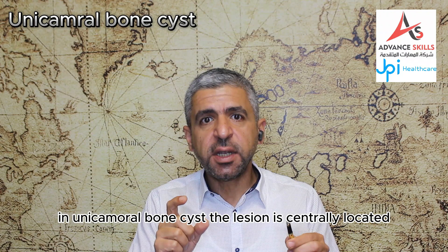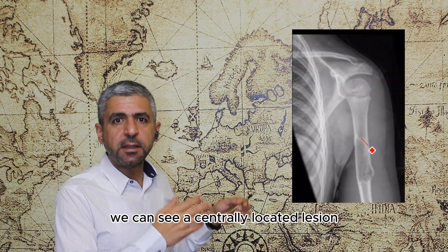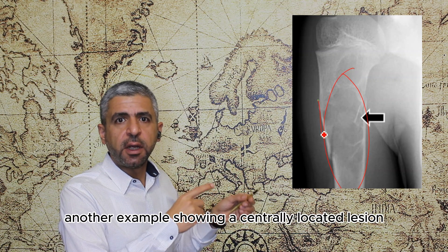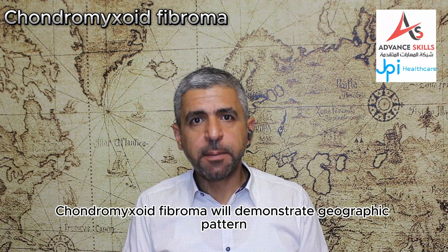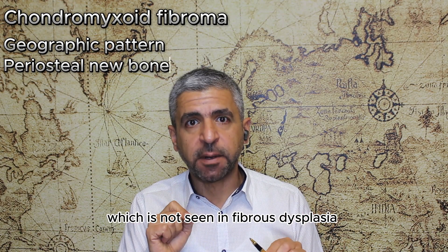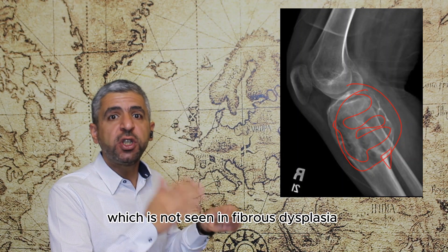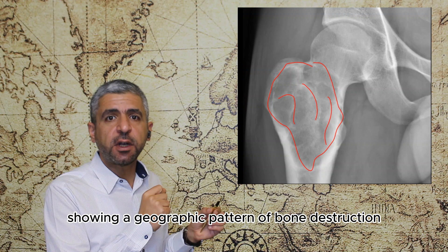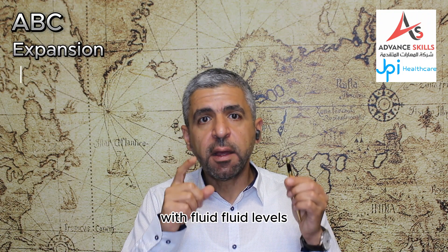In unicameral bone cyst, the lesion is centrally located and does not involve the cortex; the fallen fragment sign is seen in cases of fracture. In chondromyxoid fibroma, there is a geographic pattern of bone destruction and periosteal new bone formation, which is not seen in fibrous dysplasia. Examples of chondromyxoid fibroma clearly demonstrate the geographic pattern of bone destruction and periosteal new bone formation.